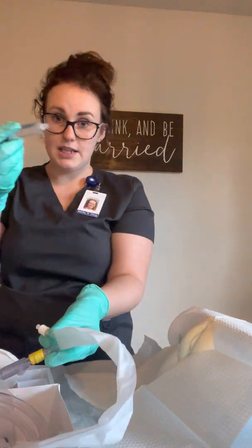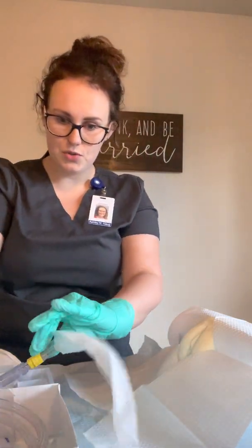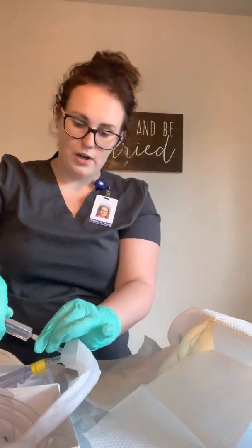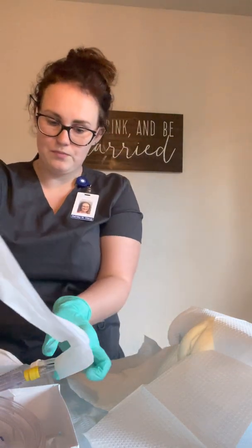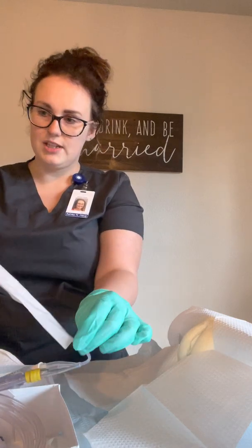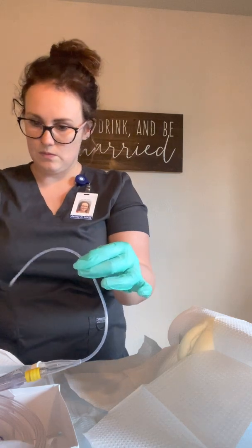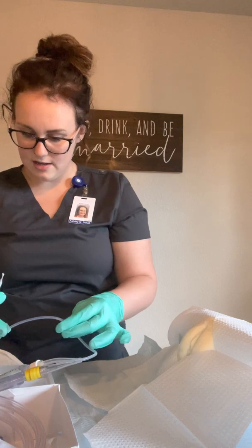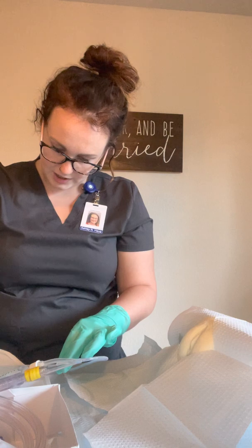I'm going to apply the syringe. I'm going to remove the lid and apply the syringe to, make sure this is staying here, where it will go to inflate the tube, and I'm going to leave that there so that once it's placed, I am ready to go. I'm going to remove the slip on the catheter, and I'm going to set it in the tray so that I can apply the lubricant.